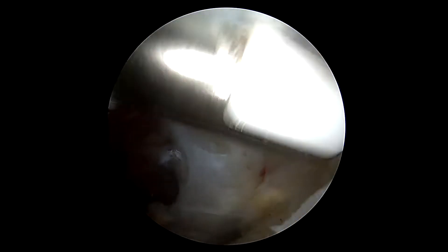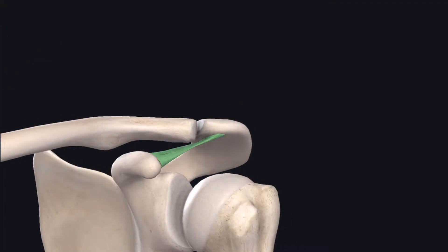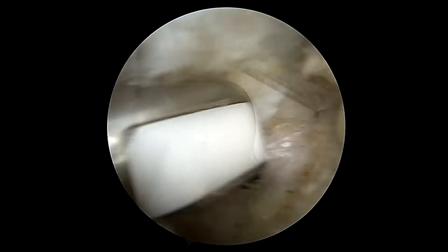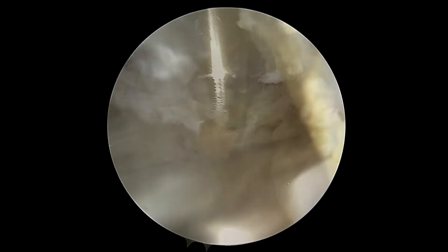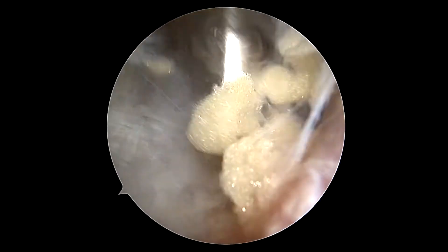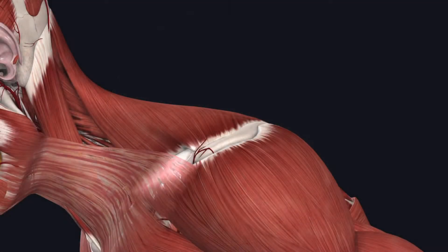We begin following the coracoacromial ligament, or CA ligament, highlighted here in green, which takes us down to the coracoid — the front bony structure of the scapula. That's an important landmark. I've identified the coracoid and will stay on that bone, carefully following it and using blunt dissection to mobilize soft tissues out of the area, which will reveal the superior transverse scapular ligament.